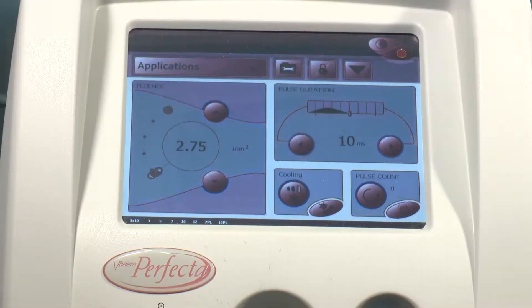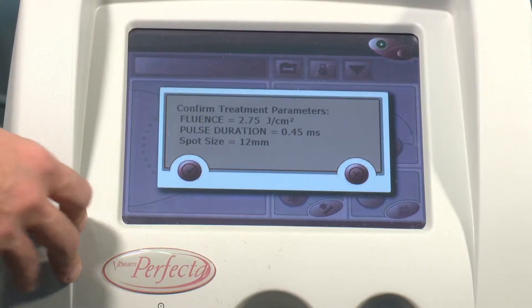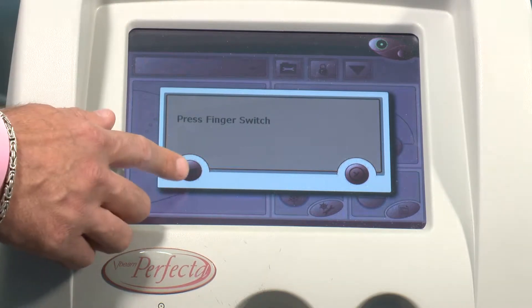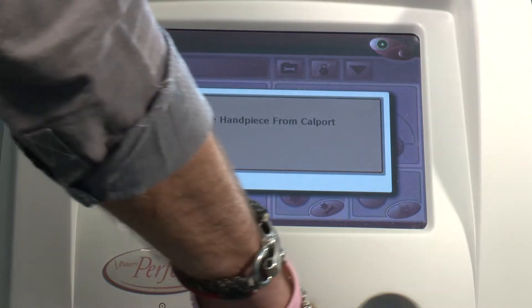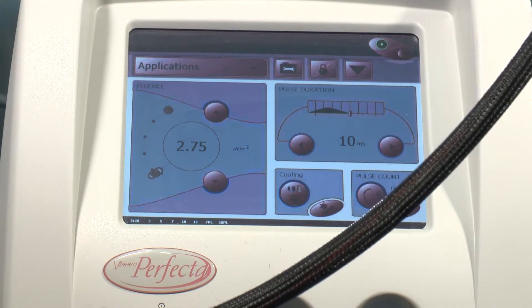We'll go to the screen where we actually calibrate the handpiece, confirm the treatment parameters, and now press the finger switch here. Calibration is complete, so now the device is ready to fire.